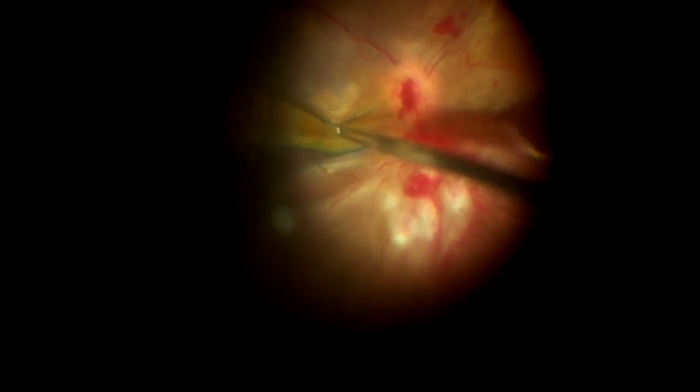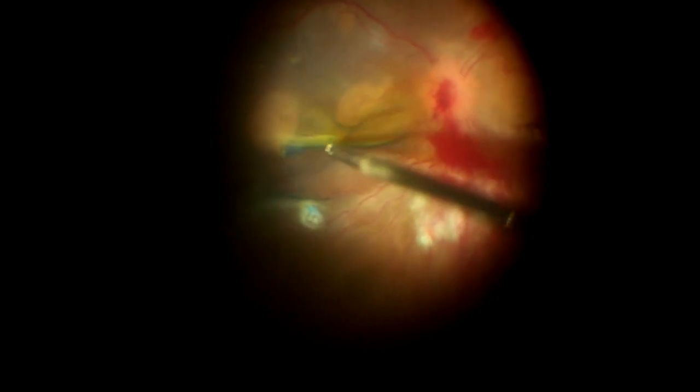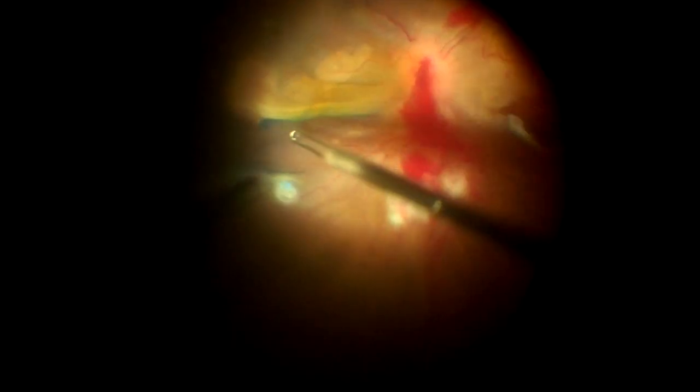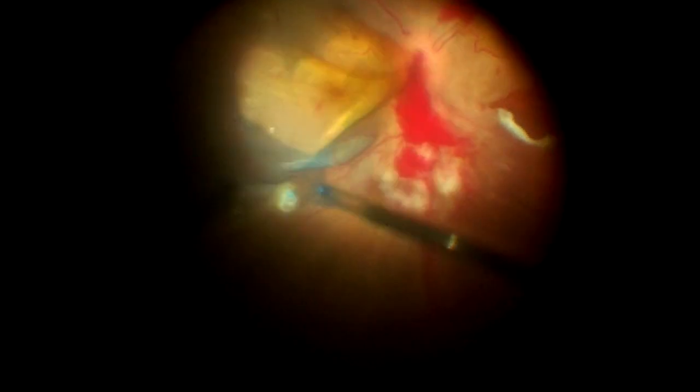I could see that when I was removing the ILM from the temporal side towards the disc, there was no fulcrum against which I could put pressure, and it was extremely difficult. Whereas when we are able to remove the ILM from the disc towards the temporal side, it will be much easier to come in a detached retina. So in this particular case, we have completed the internal limiting membrane peeling from the disc towards the temporal side, as you are seeing now. Once we finish that, then we can complete with the air-fluid exchange, a laser and silicone oil injection.